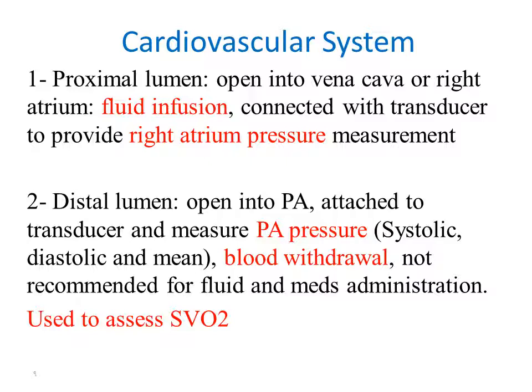It could be used to draw a blood sample in order to assess the mixed venous O2 saturation, which is the SvO2. But this lumen is not recommended for fluid and medication administration.